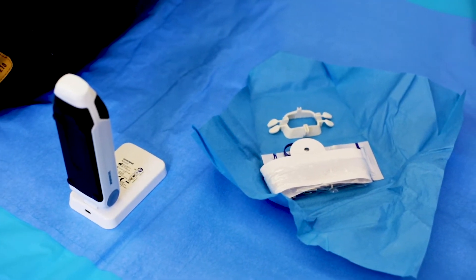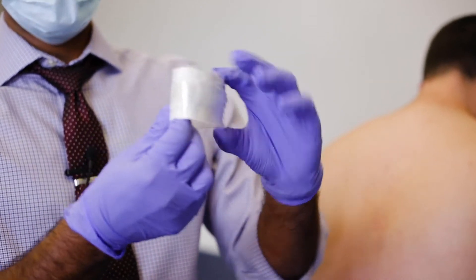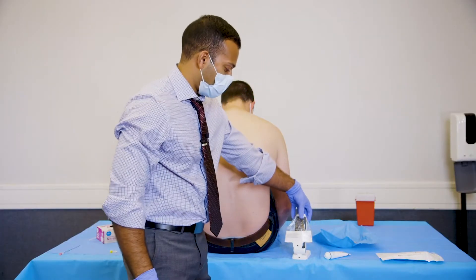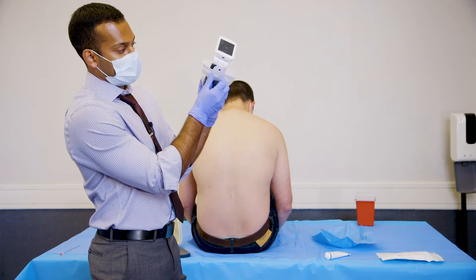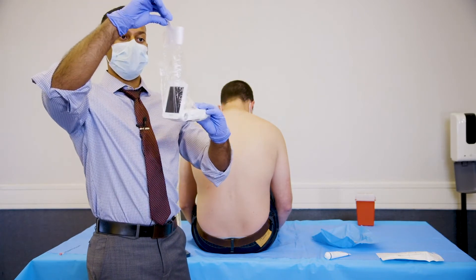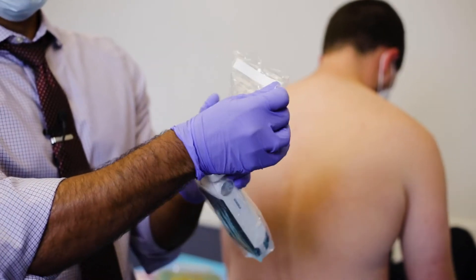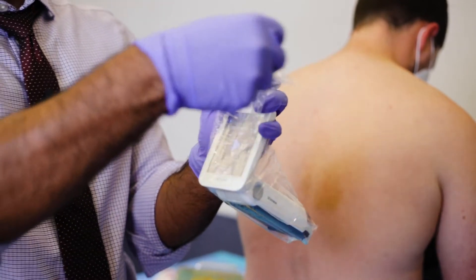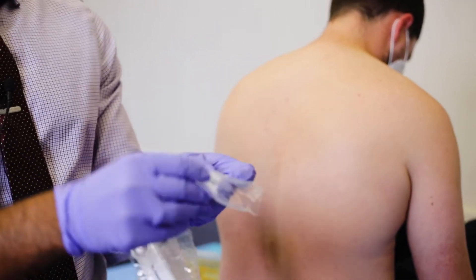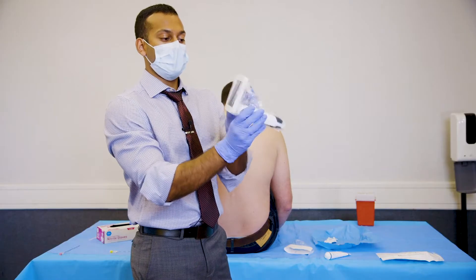Inside your kit you're going to have a few different things. The first thing you're going to want to take is the cover. Most important thing is you want to have this facing down. Place this over the probe. You're going to hold on to the tab, grab the top covered portion, pull it around, and this is going to form a film over the probe. You're then going to pull the tab and it's going to rip just the top portion — you don't need that anymore. Now you have your sterile probe cover.